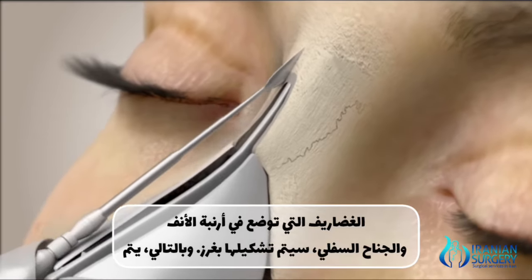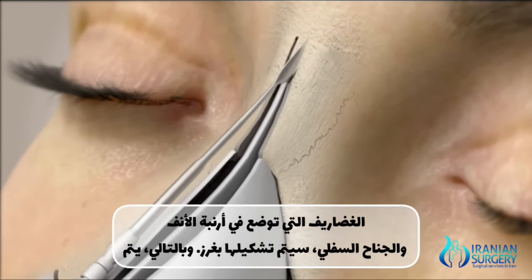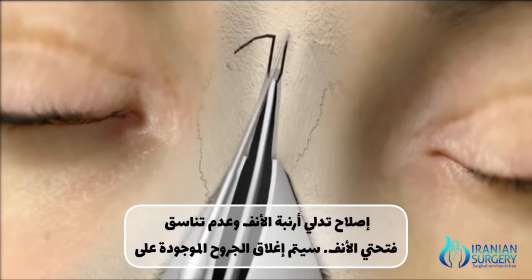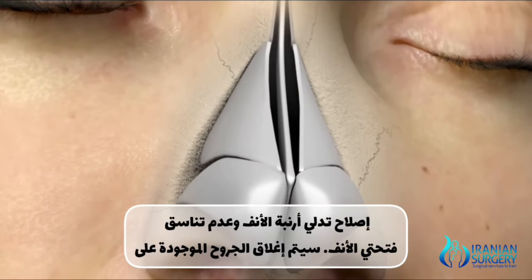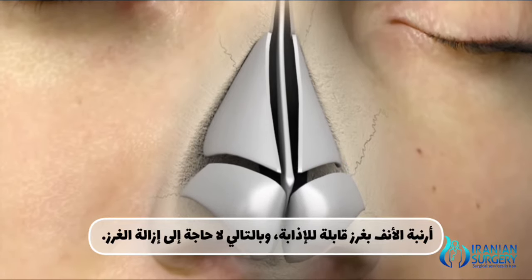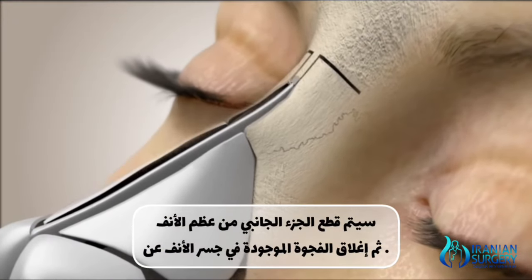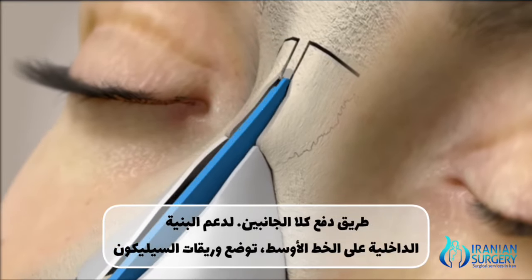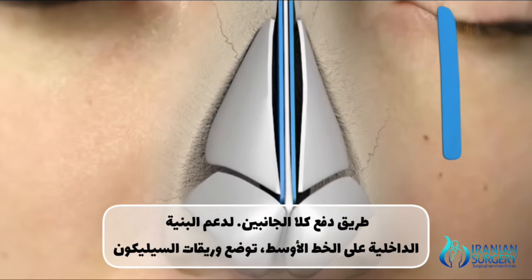After the hump is removed from the nasal bridge, right and left side of the septum will be cut vertically, and then double-sided horizontal cuts will be done at the top of the nasal bone. For achieving an aesthetic side view of the nose, upper side of the lower alar wings will be removed. After this step, cartilage grafts taken from the septum will be relocated either side of the upper septum.